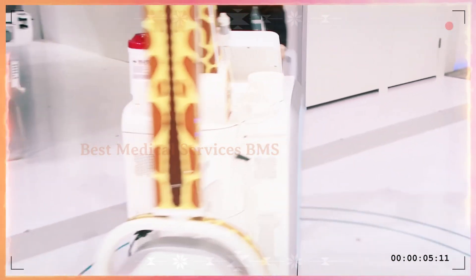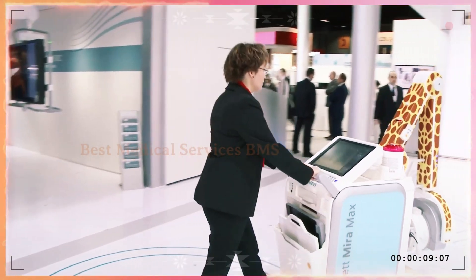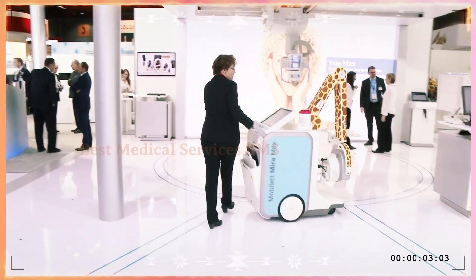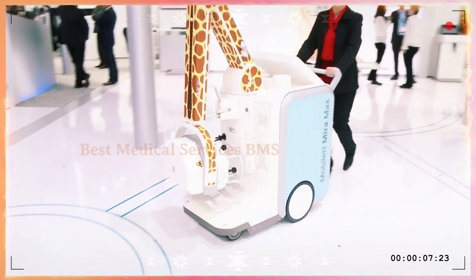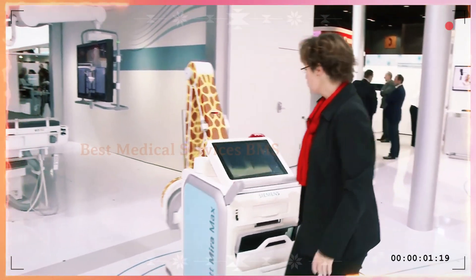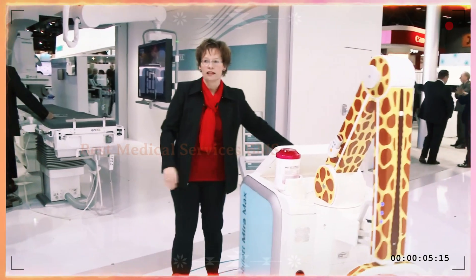For a mobile X-ray system, mobility is key. The Mobilett Mira Max is very easy to maneuver and you can walk over long distances very easily. You have a lot of room for your legs — you don't hit your knees or the detectors. It's very easy to drive because it's so light, and it's also good for small rooms where you have to position the system near your patient.